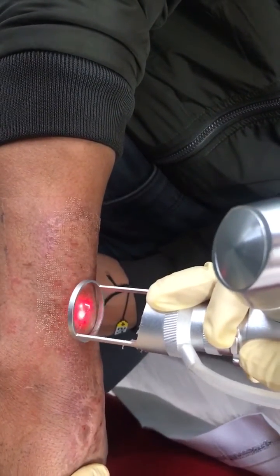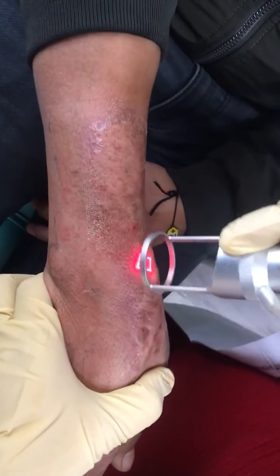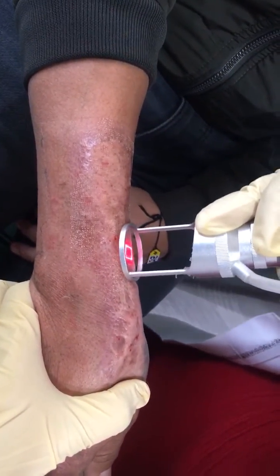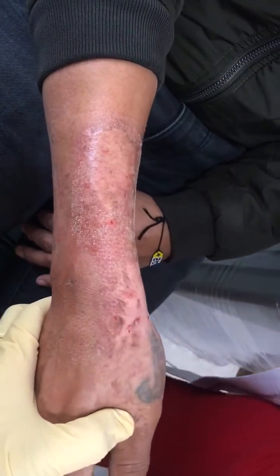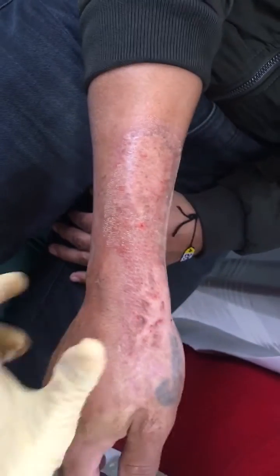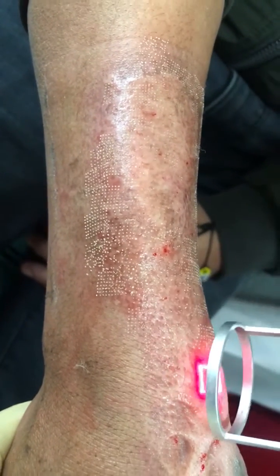I'm just covering wherever I feel there are remaining areas. Take a close-up — one can easily see the stamping pattern. It's very, very clear — the stamping pattern on the whole scar. Now we will complete the laser.